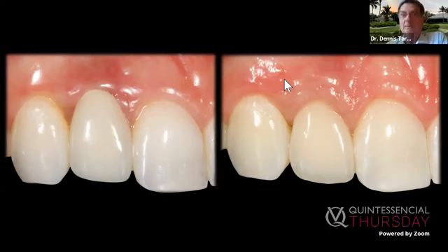Now, people always say, you get a scar here. That's an indentation, it's not a scar. Attached gingiva does not scar. There are no elastic fibers in attached gingiva. That's why we can do a gingivectomy and get away with it. It's the only part of the body that does not scar, is gingiva. Mucosa scars, but attached gingiva doesn't. It creates a groove. That groove can be plastied if you want, or it doesn't even need to be. This patient was so happy, and she came in with this. She had a groove there to begin with, see it? So it's not like she didn't have it.